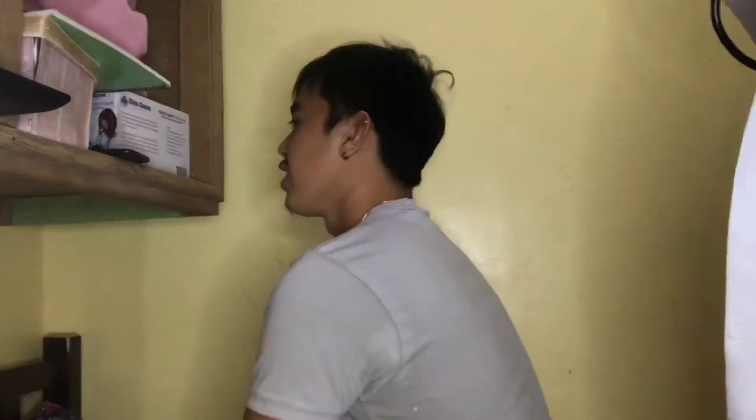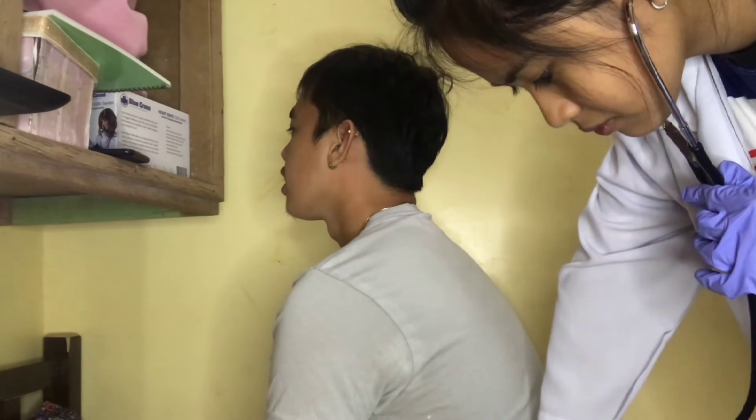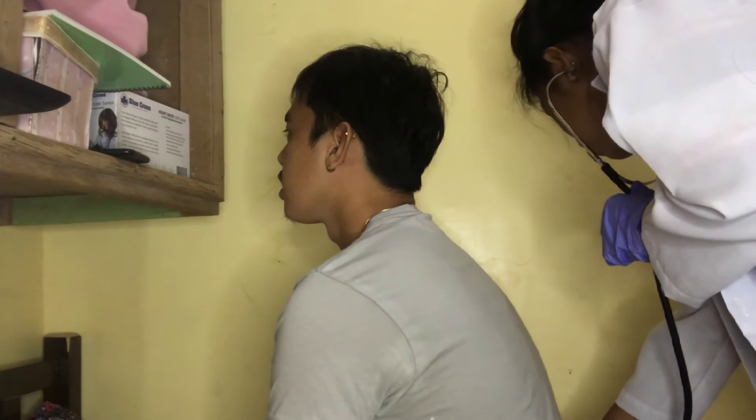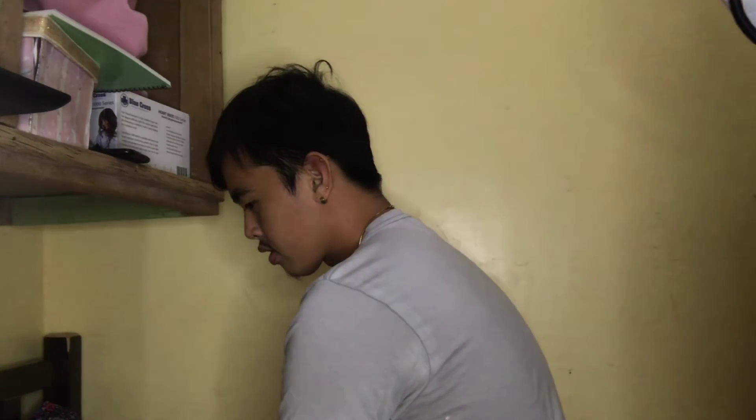Now check for aortic murmurs, which will get louder with expiration. Inhale. Exhale. Next, check for coarse crackles. Can you please turn your back, sir? As I check the patient's crackles, I can hear the crackle sounds.